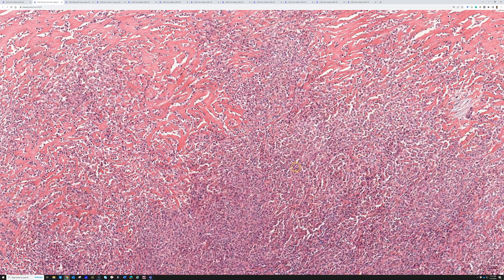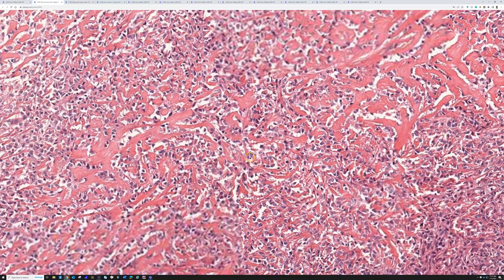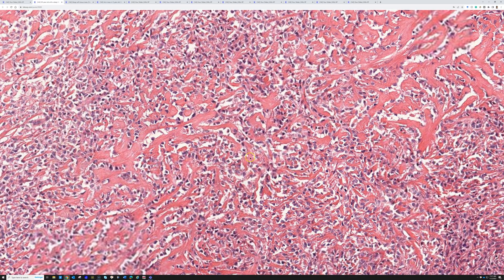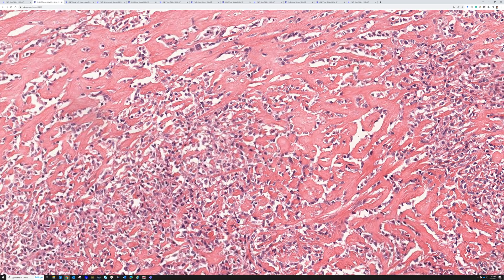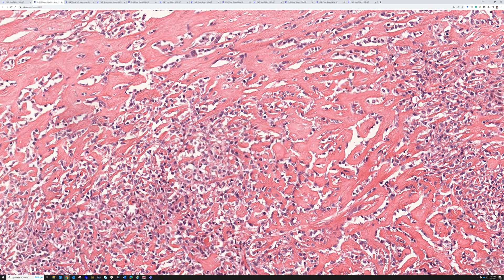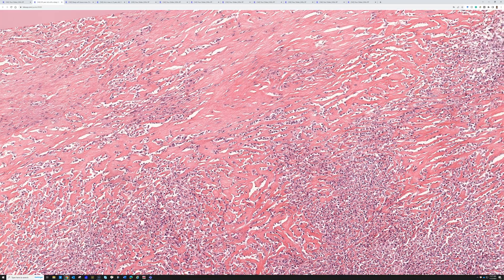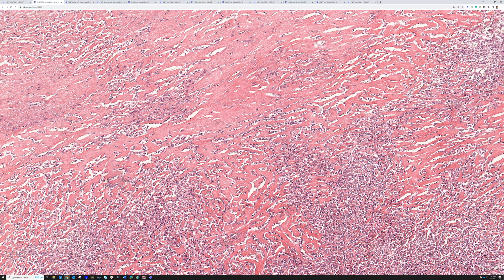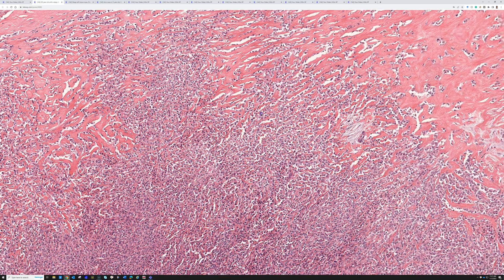The cells here are not as spindled — they're more round and blue, or even epithelioid. They're arranged in cords and chains that dissect through a background of very dense sclerotic collagen. That pattern — cords and chains of round or epithelioid cells in a dense sclerotic collagen background — is really important for making the diagnosis.